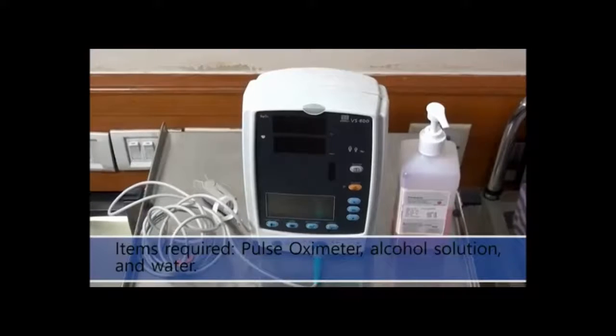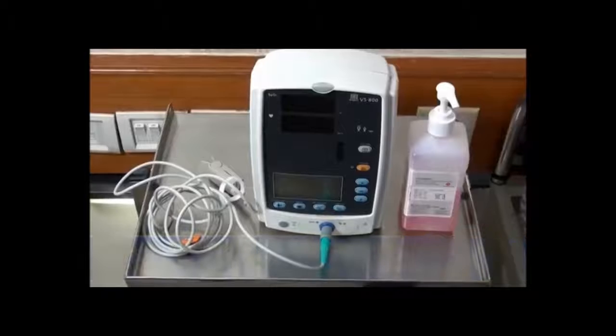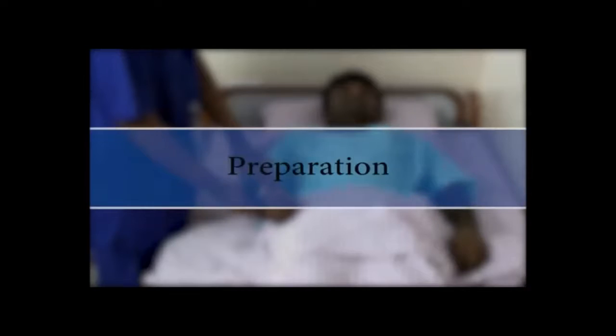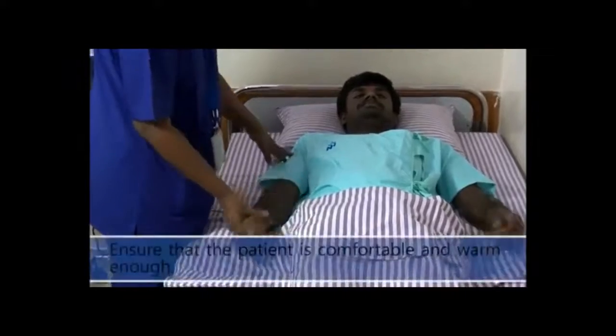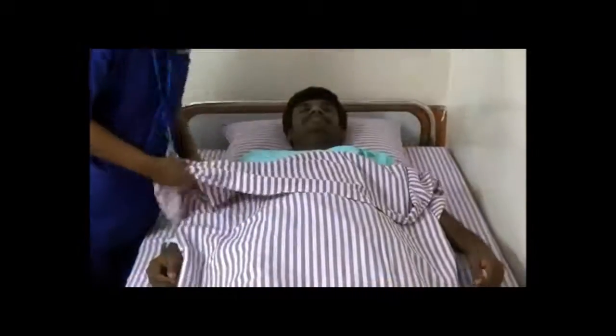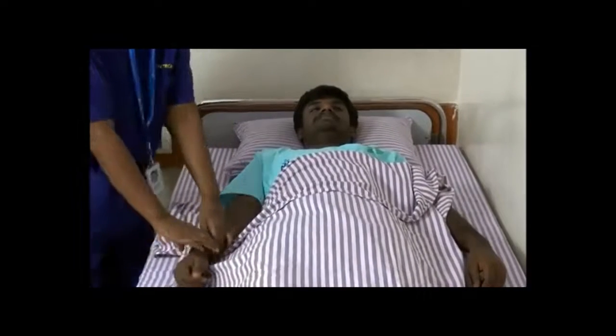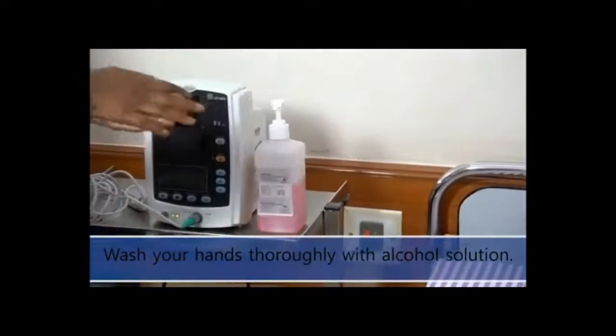Items required: pulse oximeter, alcohol solution and water. Preparation: ensure that the patient is comfortable and warm enough. Wash your hands thoroughly with alcohol solution.